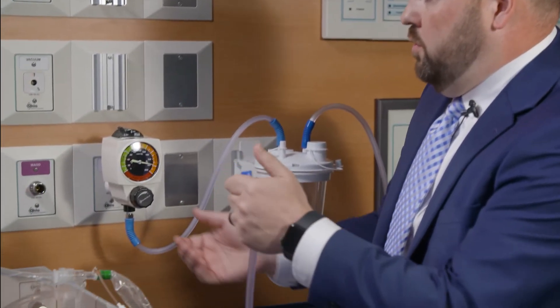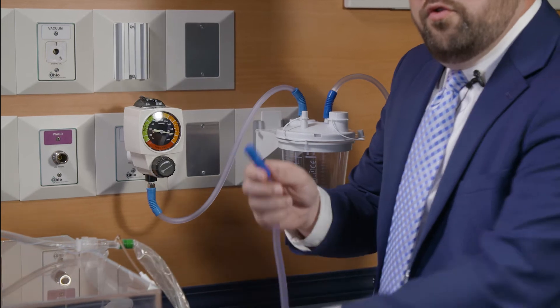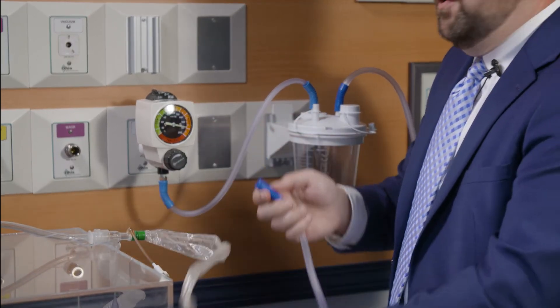I'm going to demonstrate how to properly set suction pressure using the occlude to set technique. What you're going to want to do is go to the vacuum regulator and remove the tubing from the appliance that you're using.